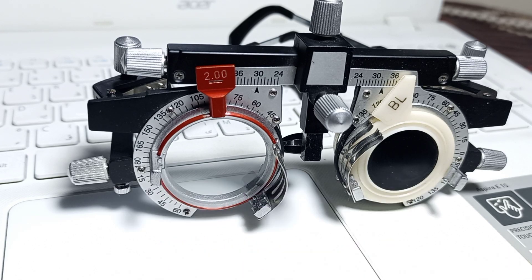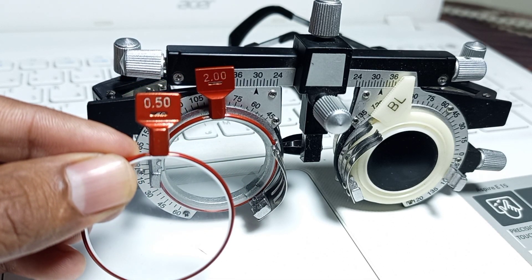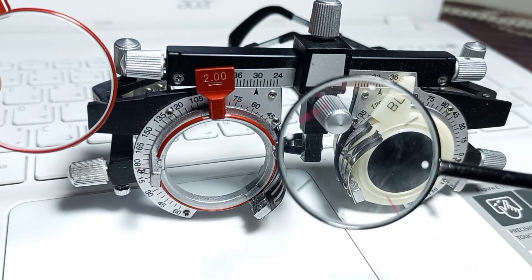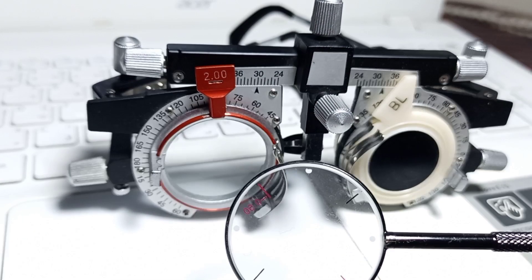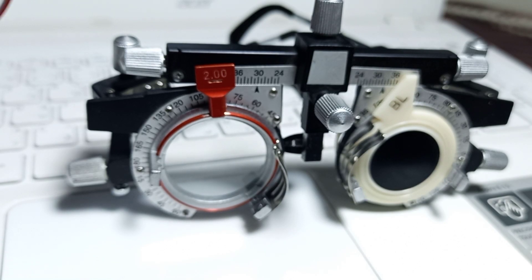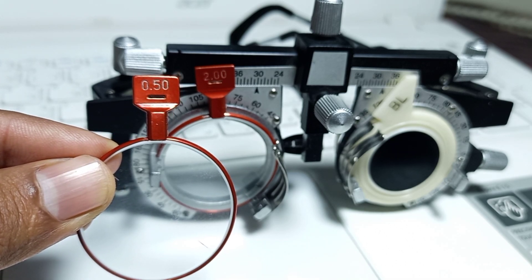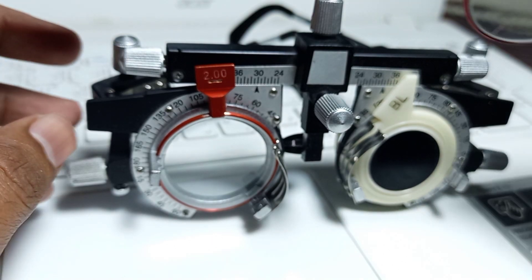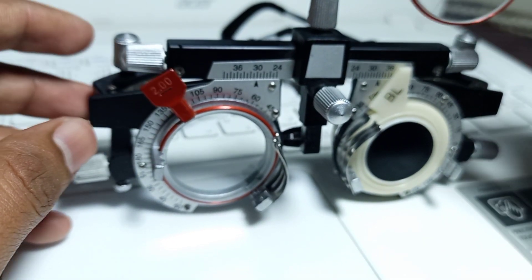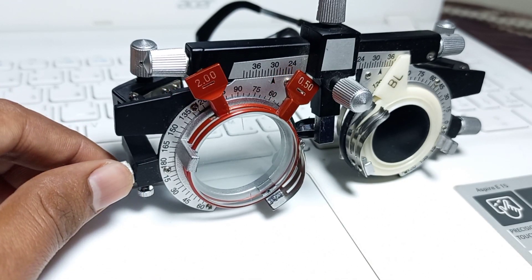If you recall the first step, called bracketing, our patient preferred minus cylindrical power at 90 degrees. Now we will put the cylindrical power from the trial box which has the same power as our Jackson Cross Cylinder — minus 0.50 — at the same axis of 90 degrees.